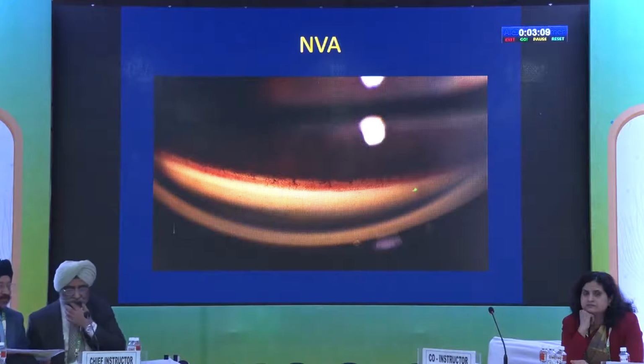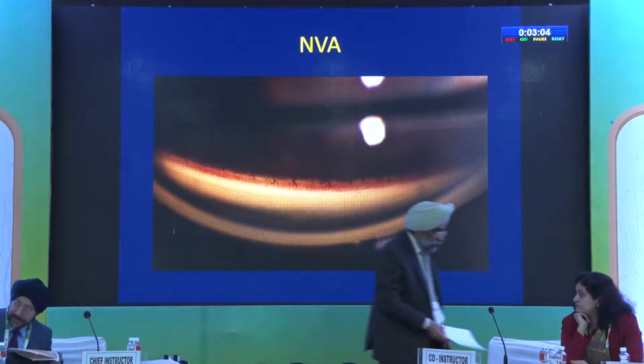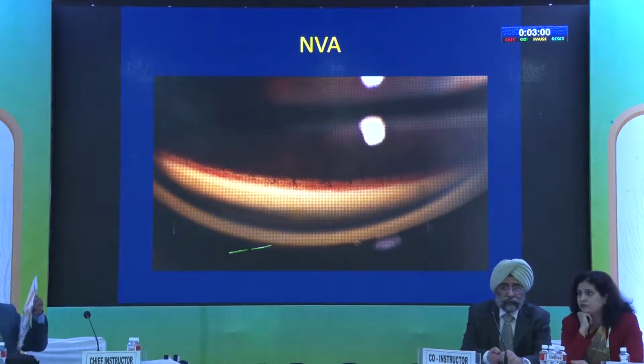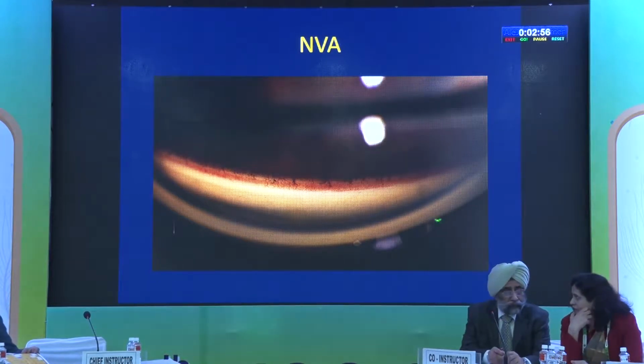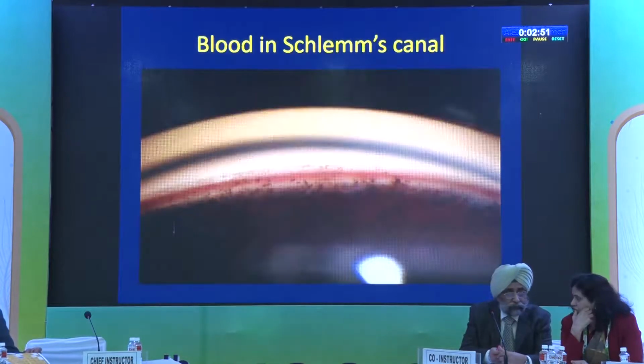While looking at the new vascularization of the iris, the new vessels are tufts of vessels that grow from the iris root. They cross the scleral spur and they arborize over the trabecular meshwork. This is extensive neovascularization that was seen in a person who had ischemic CRVO.